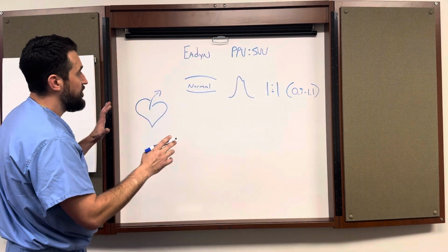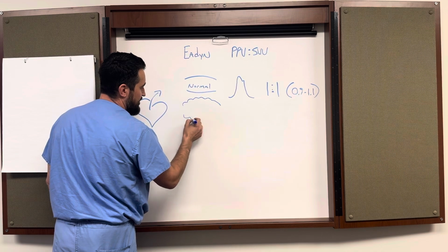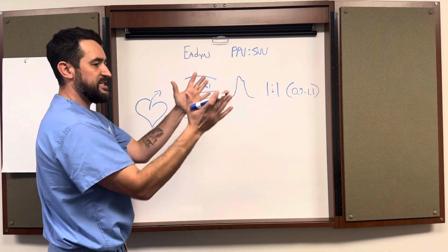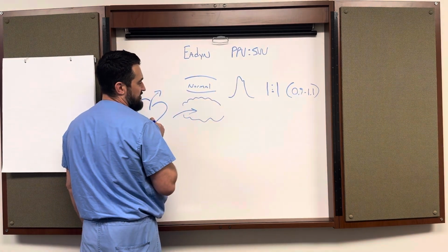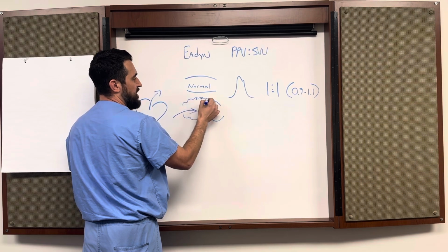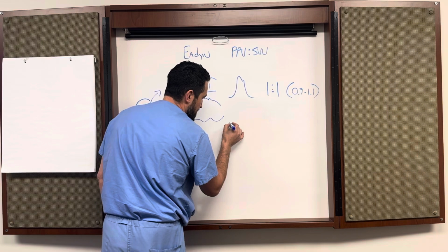Okay, so when we have very, very floppy vessels, the vessel stretches and stretches and stretches, but it doesn't have that elastic ability to snap back. What happens is the volume comes into that vessel, the pressure starts to rise, but some of the pressure gets dissipated into the vessel wall, and because there's no tone there, our arterial tracing would look different.